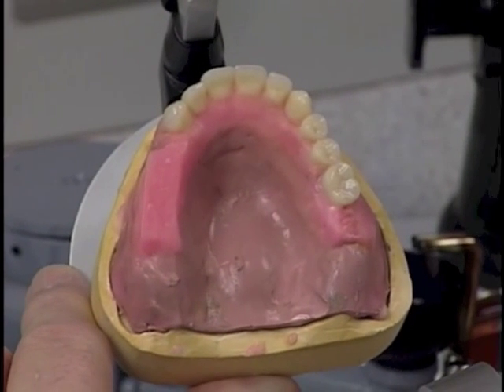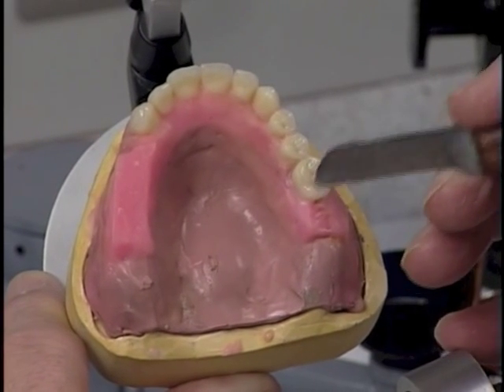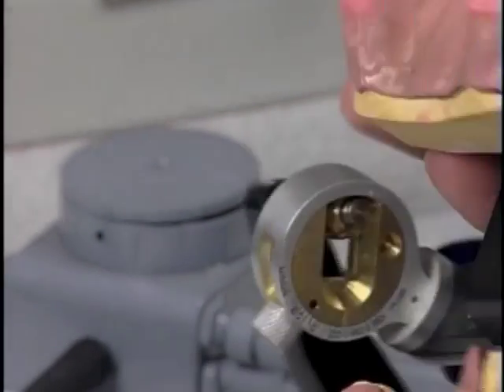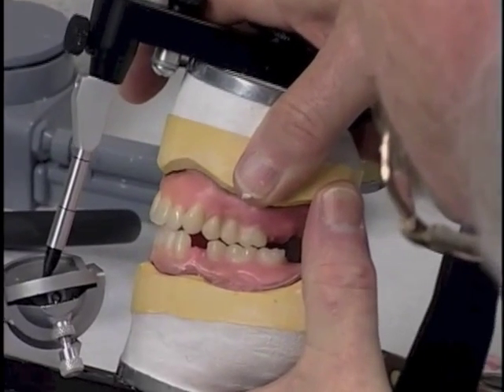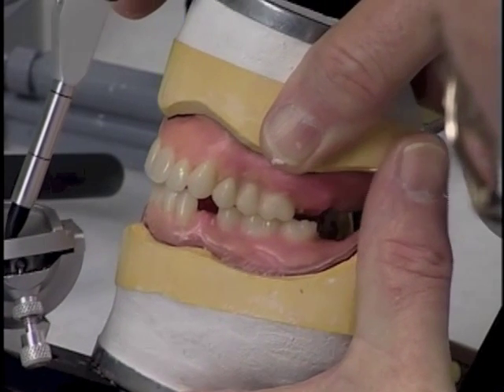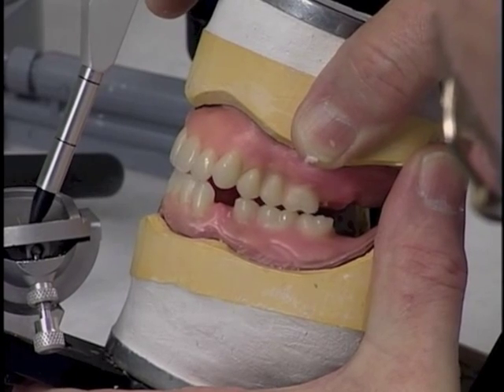Make sure that we have no wax left on the occlusal surfaces of any of the teeth. A little bit right there. And no wax down here. And now we have the maxillary first molar in place, with good working contacts and good balancing contacts. It should also exhibit good protrusive contacts, which it does.